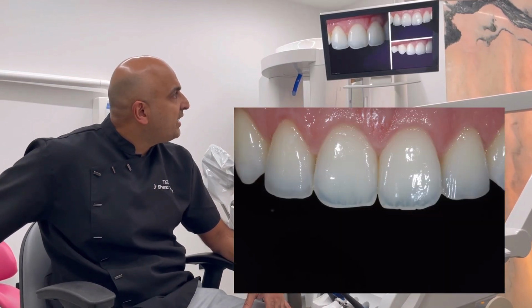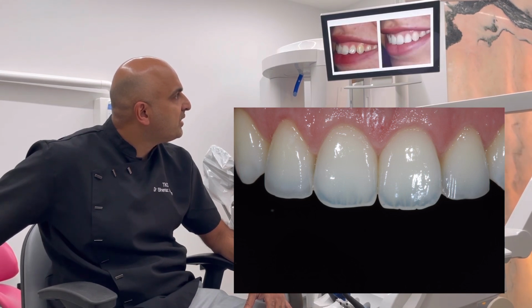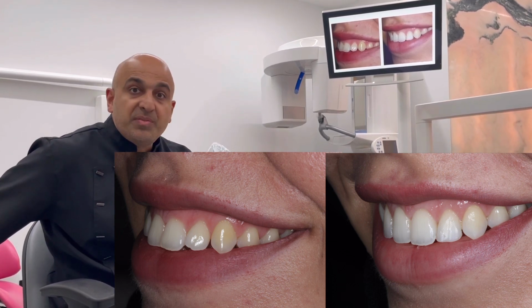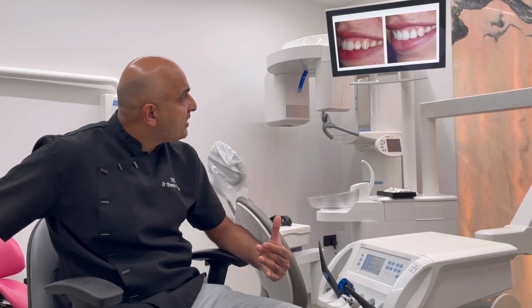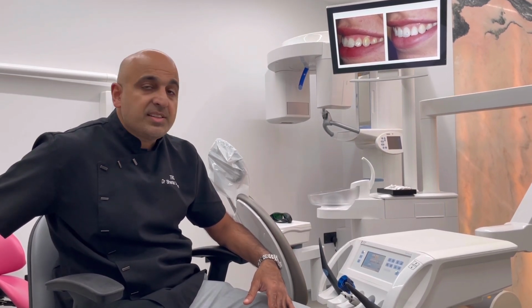You can see it here, translucency here, it's nice. The patient did have some whitening at the end of the treatment, so this just shows you the before and after from a side view, so you can really see what we were able to do. Tuck the teeth in, give a nice alignment, a bit of tooth whitening, and yeah, it's a nice simple case.